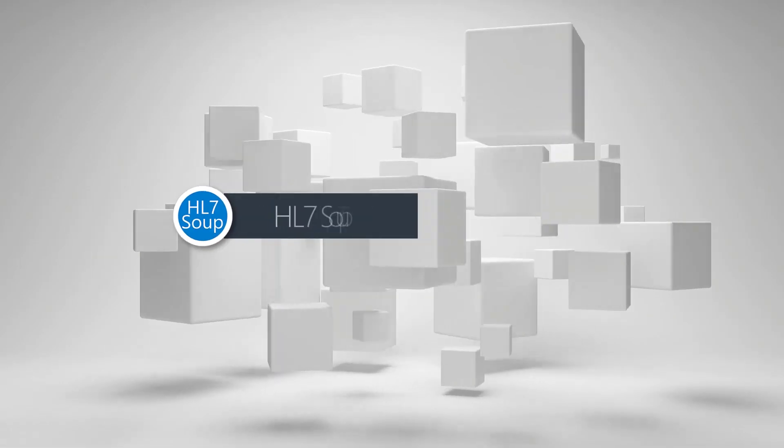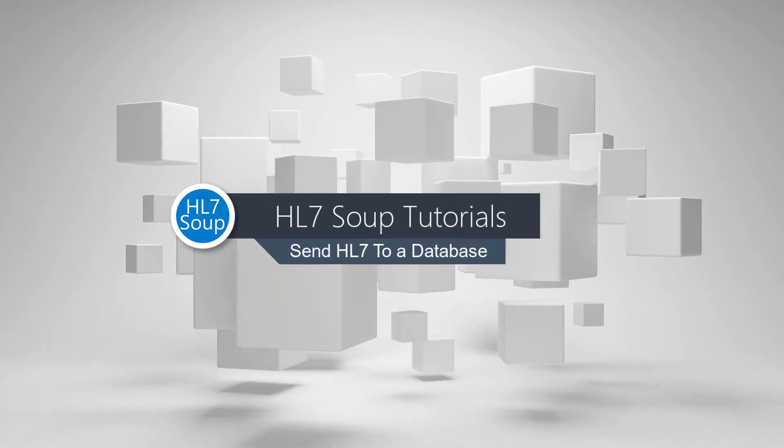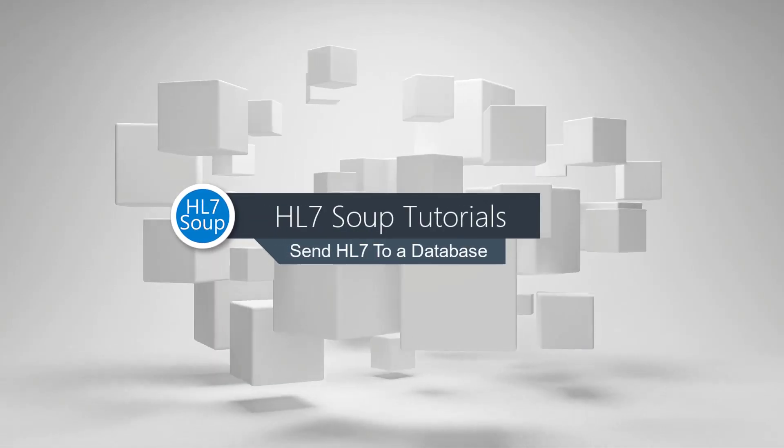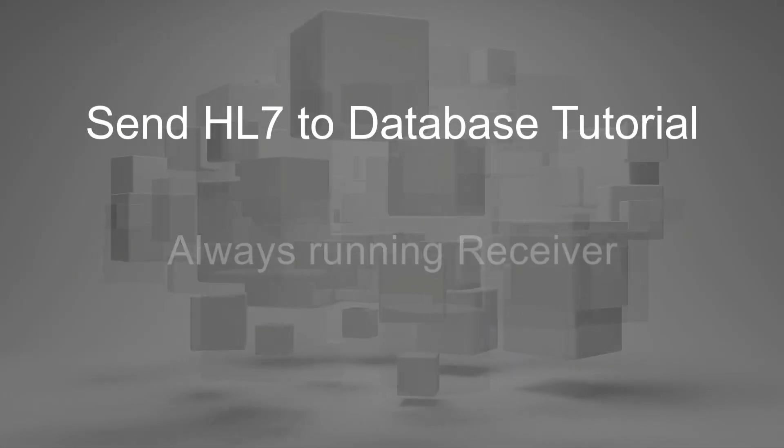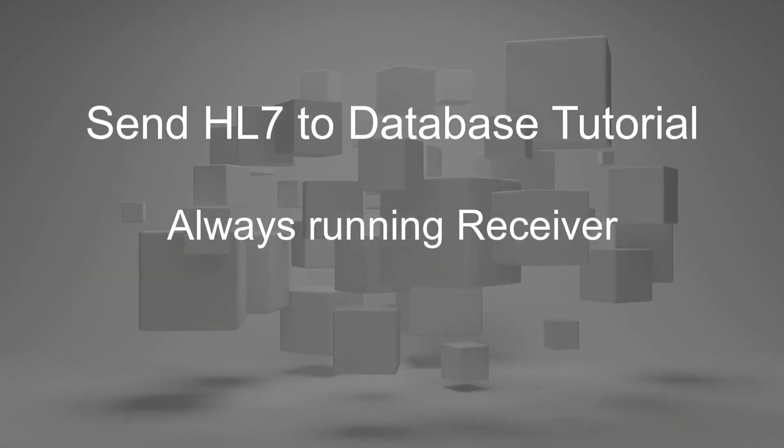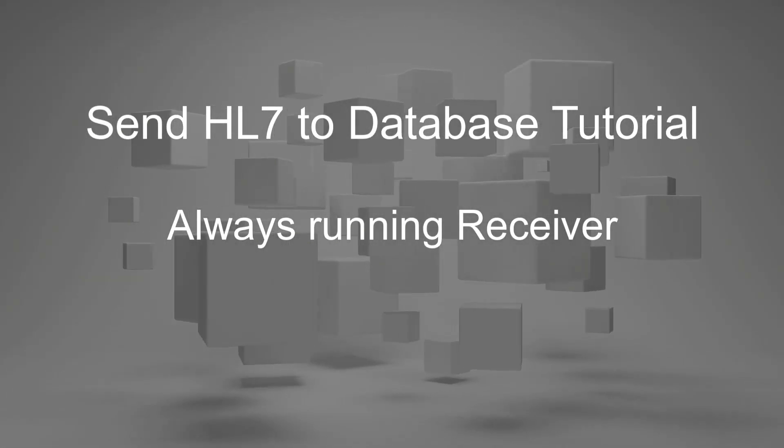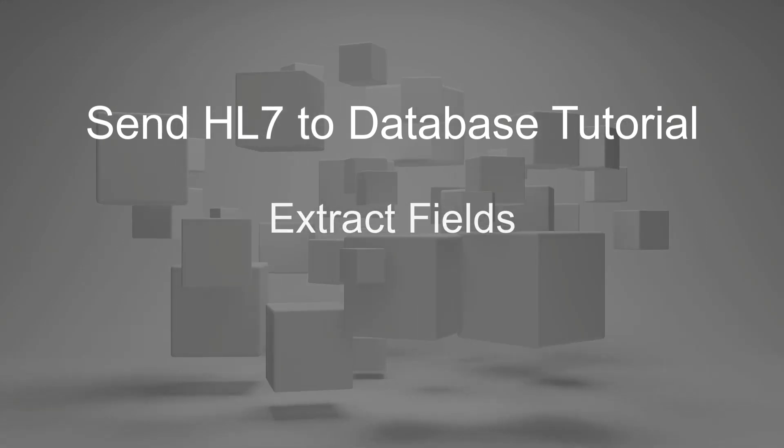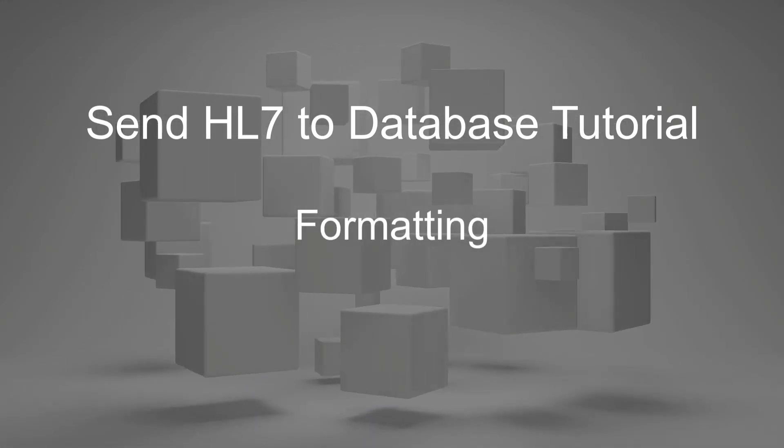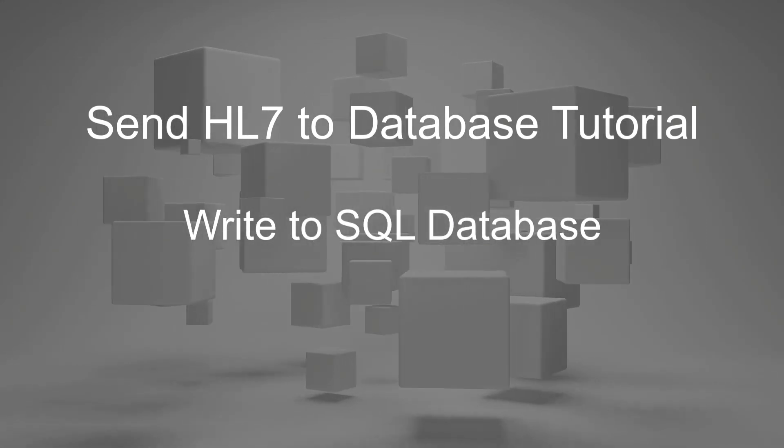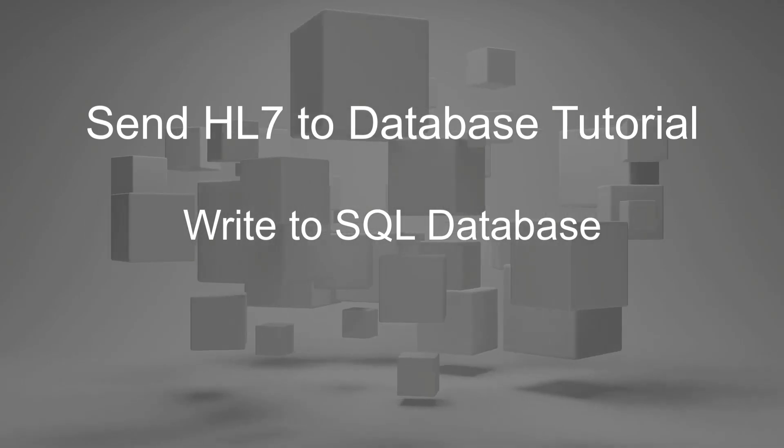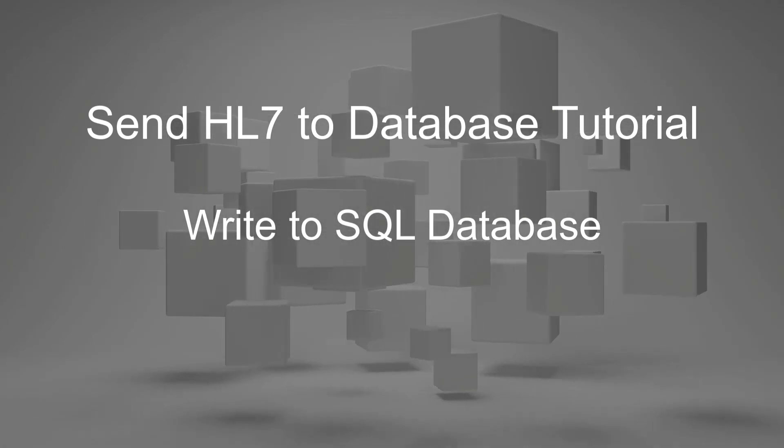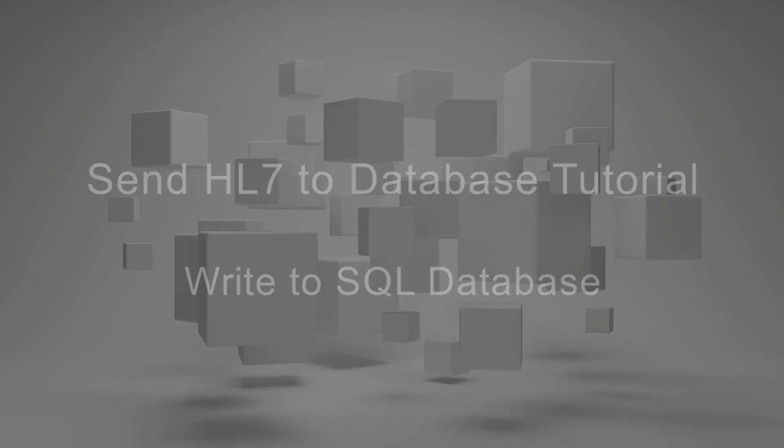In this tutorial, we're going to show you how to send values from an HL7 message to a database. We'll set you up to have an always running receiver of HL7 messages that will extract your desired fields, format them, and write them to a SQL Server database. Our example will be with SQL Server, but other databases are very similar.